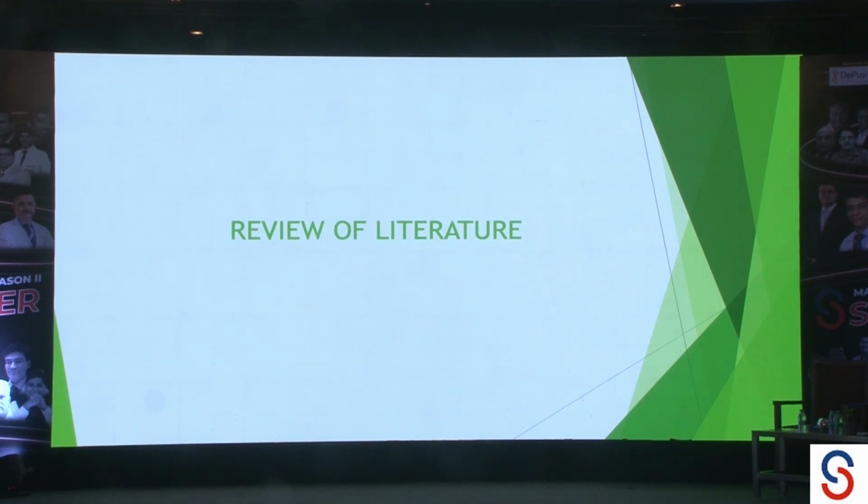That surprises us. Another factor which comes to our mind is that subsequently, when we opened, the stem was also found loose. Initially on the table, the stem was feeling stable, but your stem was rotated, and probably the height of the stem also must have changed. So there might be a subsidence factor there. Maybe the plane of anesthesia was also a bit deeper.